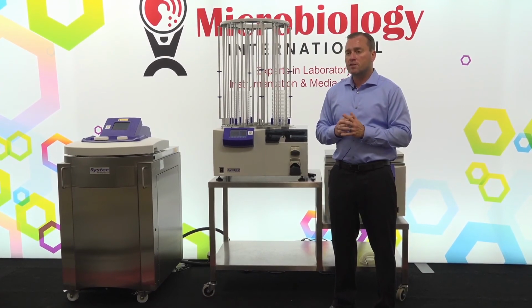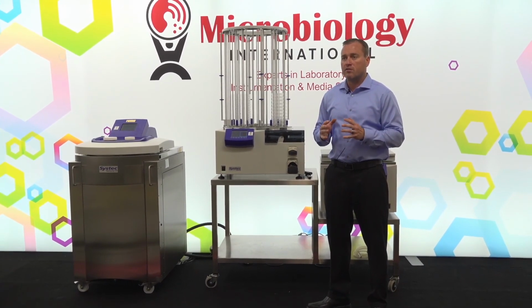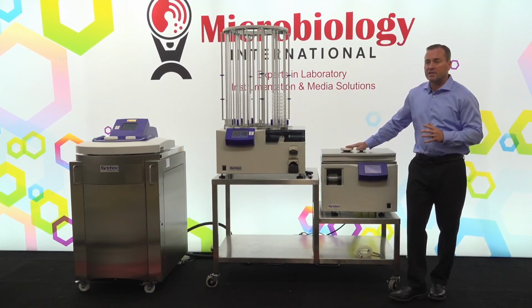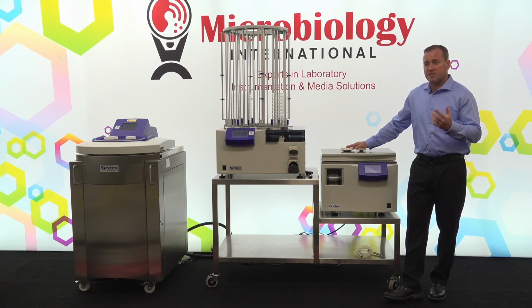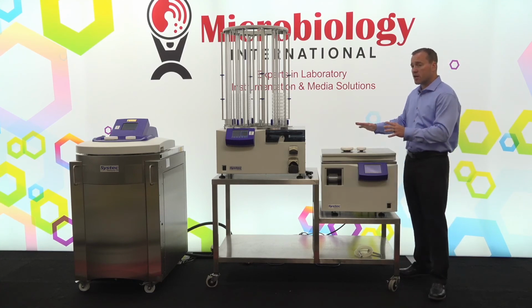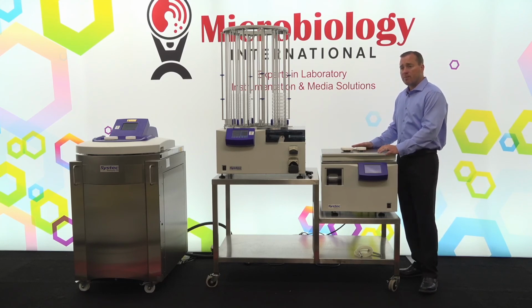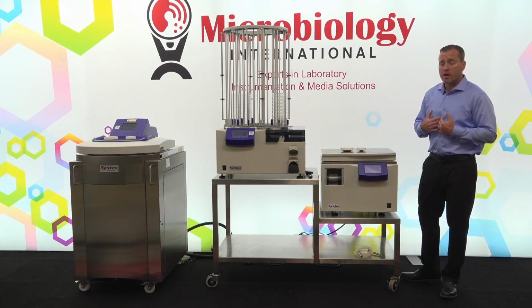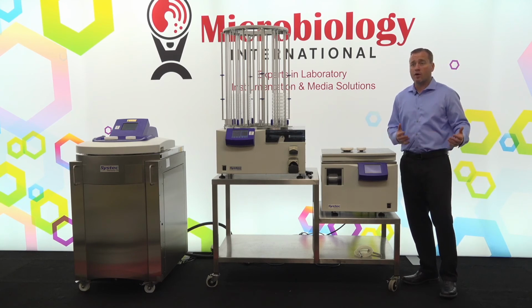So the service that we would recommend for any of these instruments, as far as the MediaPrep system is concerned, there is a pre-programmed cleaning cycle on all of our MediaPrep units that is run without the vessel. That goes to a higher temperature and pressure than any of the standard cycles would run. And what that allows us to do is it allows us to flush everything out of this instrument. So we would recommend, depending upon use, running that either weekly or bi-weekly. So you would run that for all of the instruments that we have in our production. We run them every Friday. So all of our instruments would get a cleaning cycle ran on them.